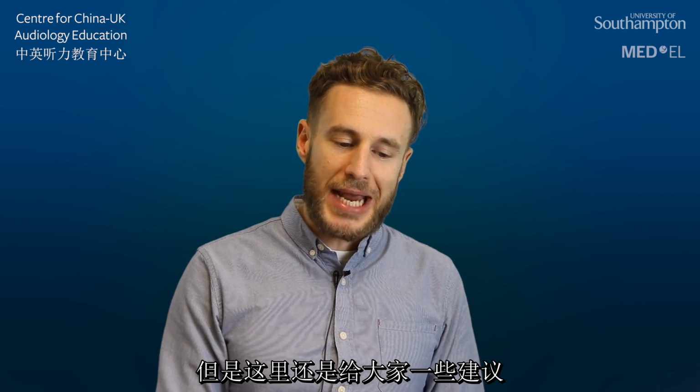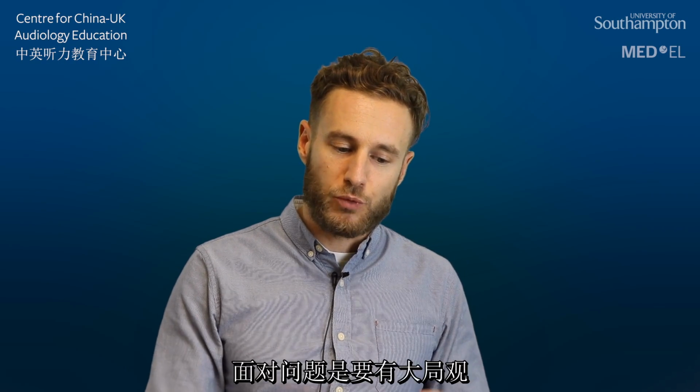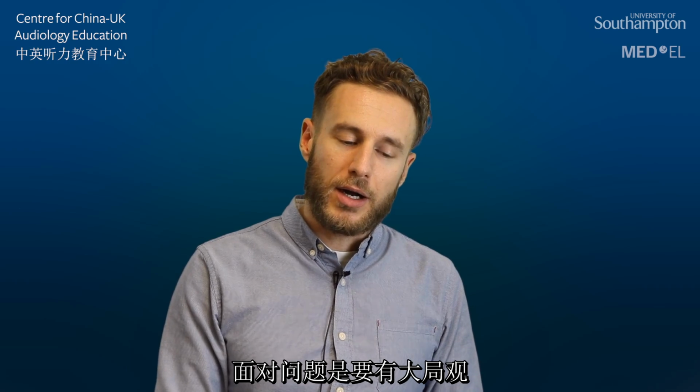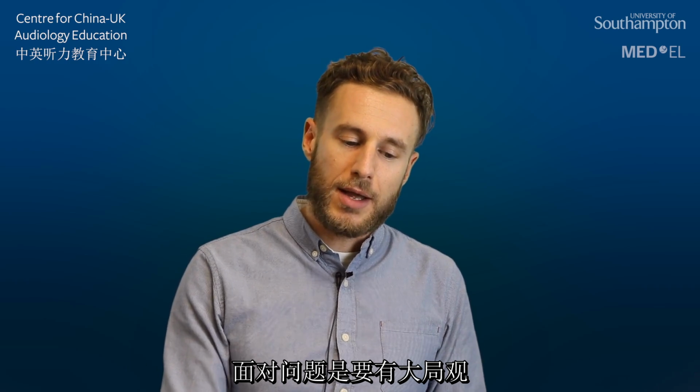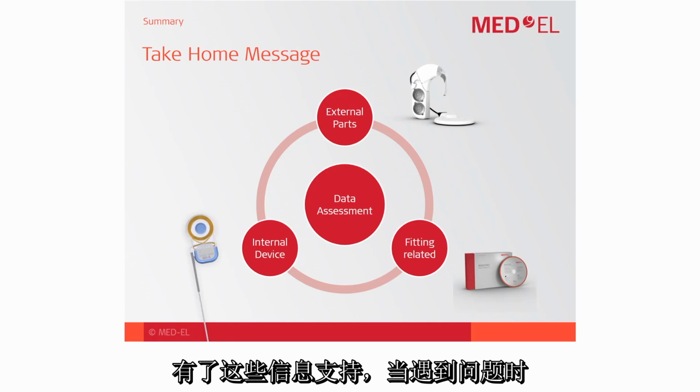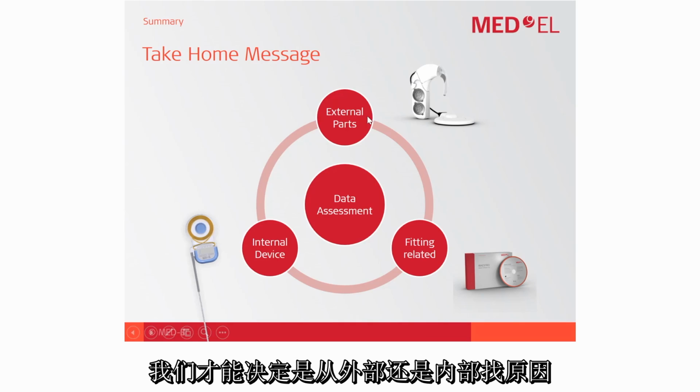Okay, so as a take-home message, always have the whole picture in mind when you are confronted with troubleshooting. First of all, data assessment is very helpful, as the more background information available, the better. And then if you know when, where, and under which conditions a problem occurs, you could start with either external parts troubleshooting, implant related troubleshooting, or fitting related troubleshooting.